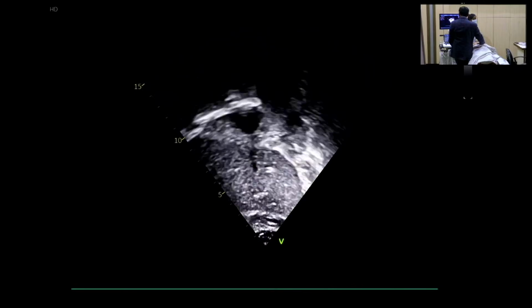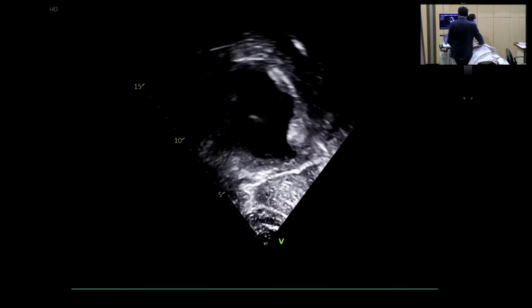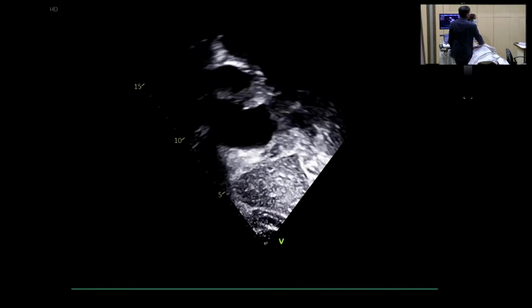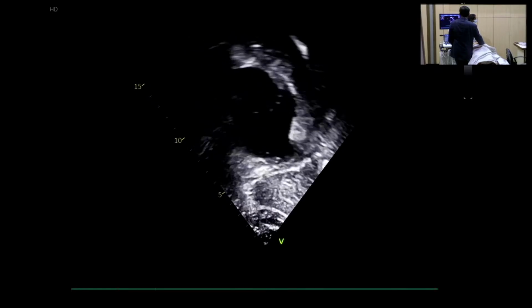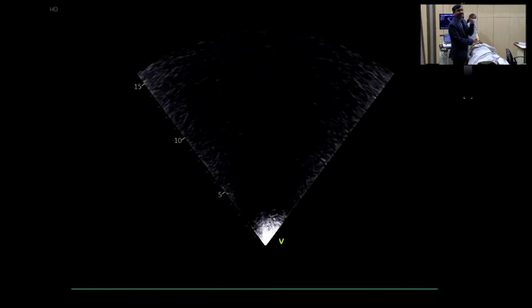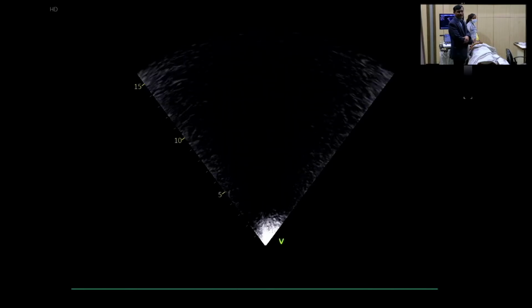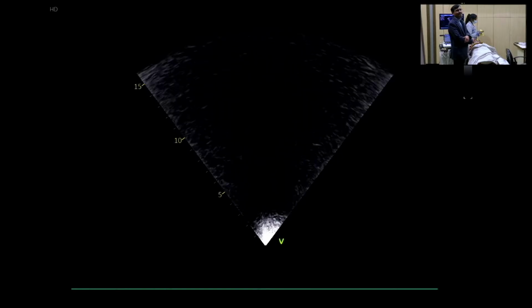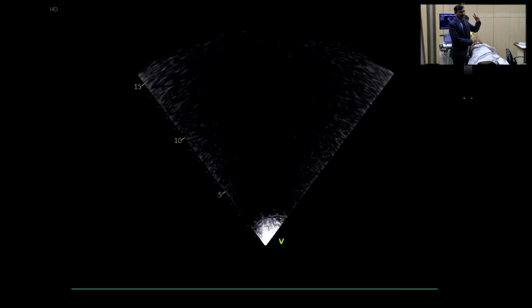So now, okay, one more thing is here. Someone asked me in the morning. This is also coronary sinus. Yes. See this. So there are two possibilities of dilated coronary sinus. Yes, I still have a chocolate remaining. Dilated coronary sinus DD. That is not an answer. Two. LSVC is one thing. And unroofed होगा तो dilated coronary sinus नहीं होगा.